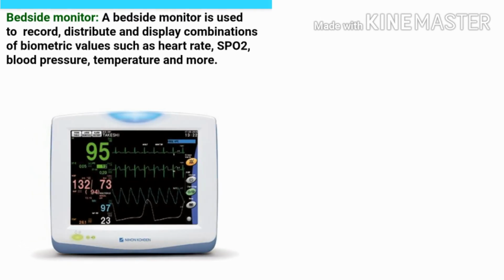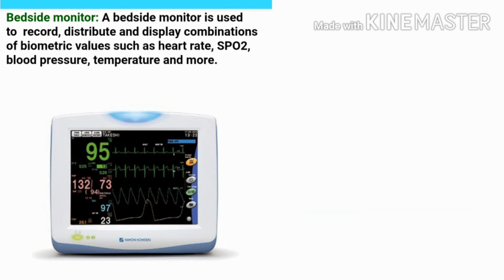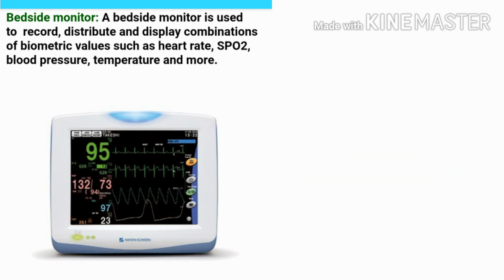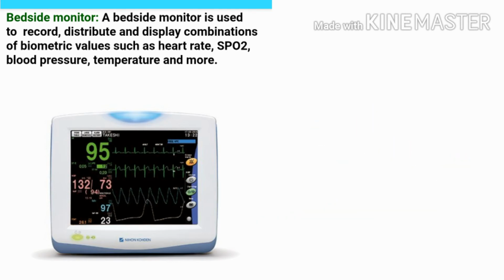And the next image is the bedside monitor. A bedside monitor is used to record, distribute and display combinations of biometric values such as heart rate, SpO2, blood pressure, temperature and many more things. So this is the bedside monitor, and this is used in the ICU setup. This is a very important instrument.